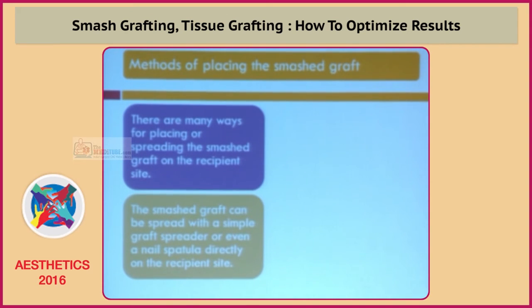Now, how do you place this smash graft on the dermabradated surface? There are many ways. The smash graft can be spread with a simple graft spreader or even a nail spatula. You just spread the paste-like material all over the dermabradated surface.